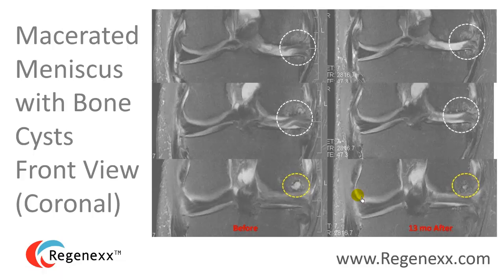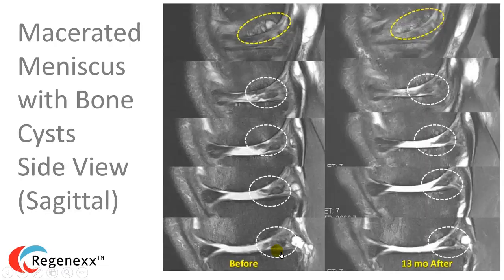A macerated meniscus with bone cysts shows what happens long-term when a meniscus is not there — the bone will actually die off, forming these little cysts. On the before images, you can see a very nasty-looking meniscus that barely resembles one, compared to the normal dark triangle on the other side. After stem cell treatment, the meniscus has some form to it — not normal by any stretch, but improved. The bone cyst went from large to much, much less. From the sagittal view, the macerated meniscus looks almost like an untamed dragon, but after stem cell treatment it has much better form and the bone cysts go away.